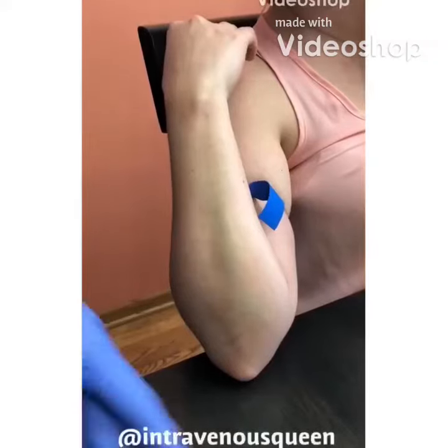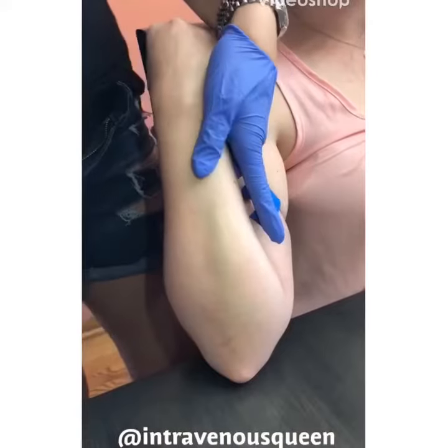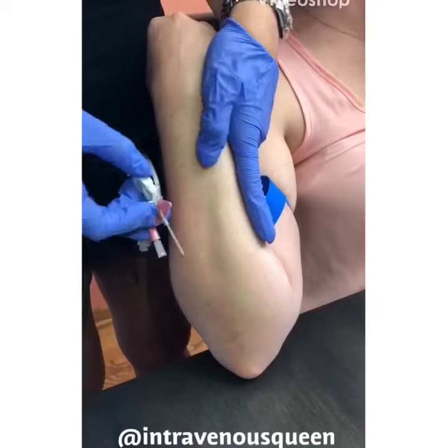When you're inserting an IV into the posterior side of a patient's forearm, you don't need to use two tourniquets because the degree to which their arm is bent acts as a tourniquet as well.